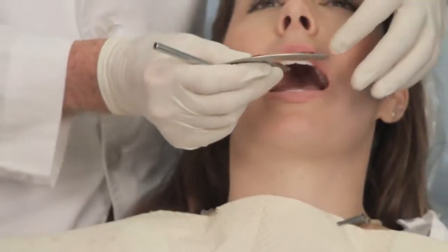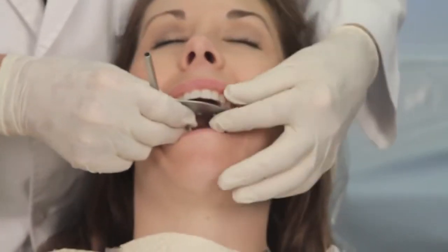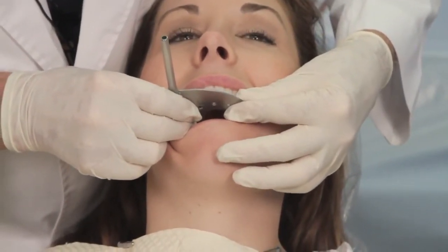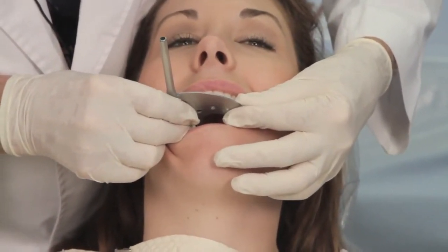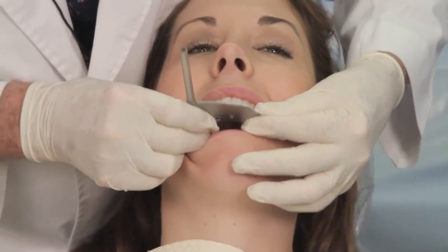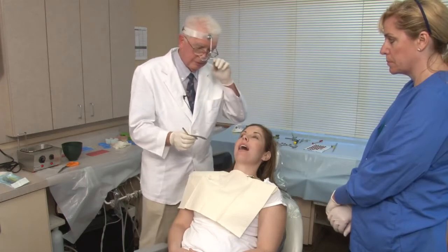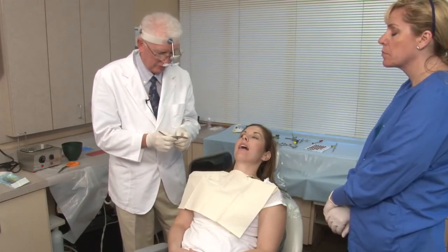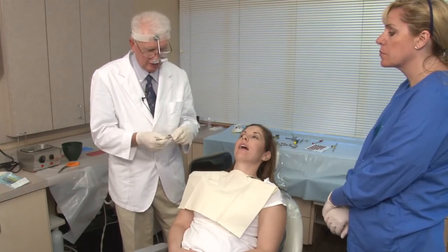In other words, I'll come in like this, get it positioned, and then I will lift. Like so. Up, and then just pop it off. Now, if you want to, you can use air and chill it a little bit before you pop it off. Not that important, really.